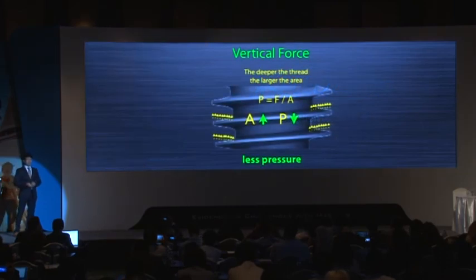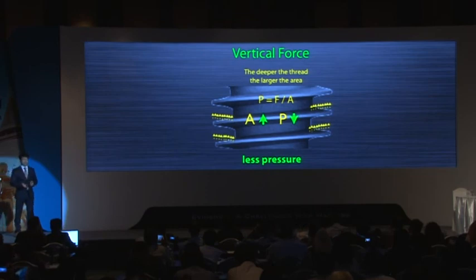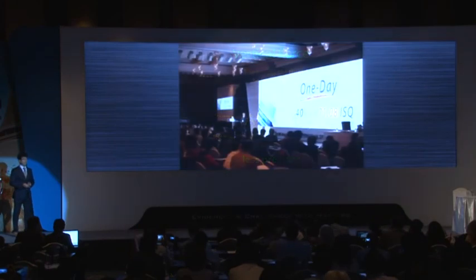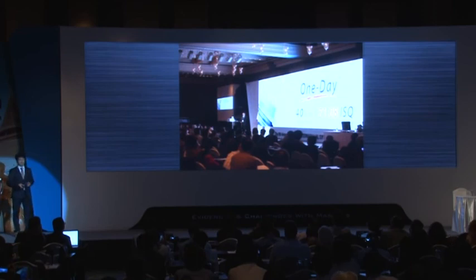You already saw this picture in Dr. Lin's lecture yesterday. There may be many biomechanical factors that we still don't know. But the obvious thing is there is no decrease of Anyridge's stability. So immediate loading after immediate implantation can be possible. But I never promise immediate loading to patients, because if the implant fails after promising immediate loading, then what am I supposed to do?